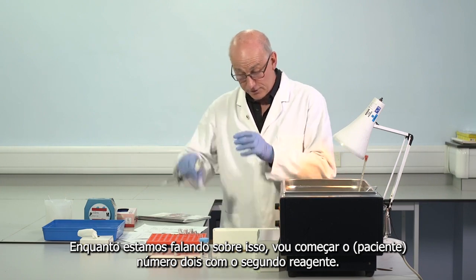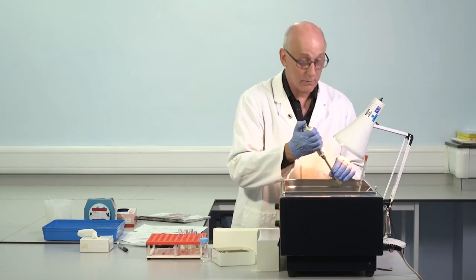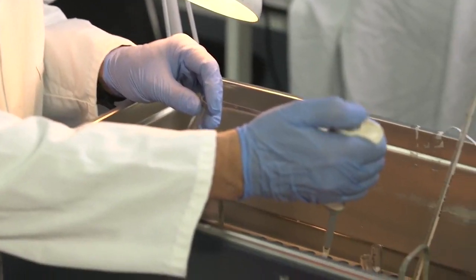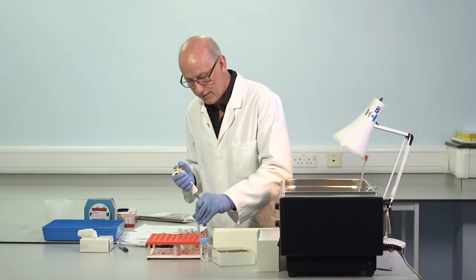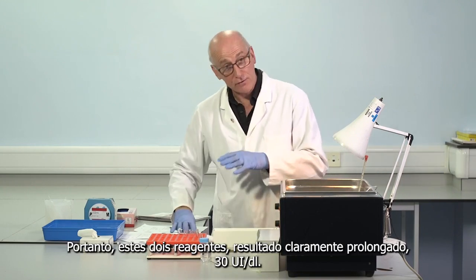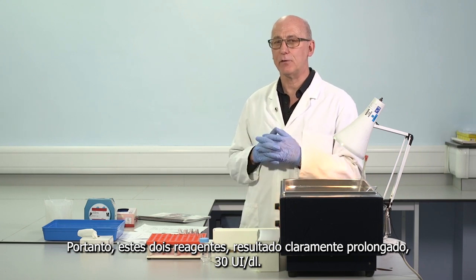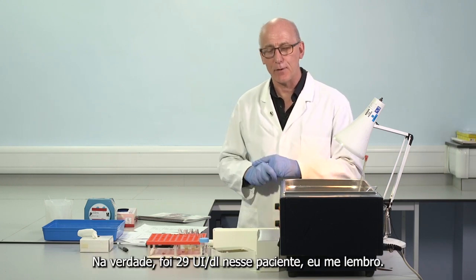Just whilst we're talking about that, I'm going to start number 2 with the second reagent. We only have a few more tests. Bear with us. So these two reagents, clearly prolonged result, 30 international units per deciliter. Actually, it was 29 in this patient, I remember.